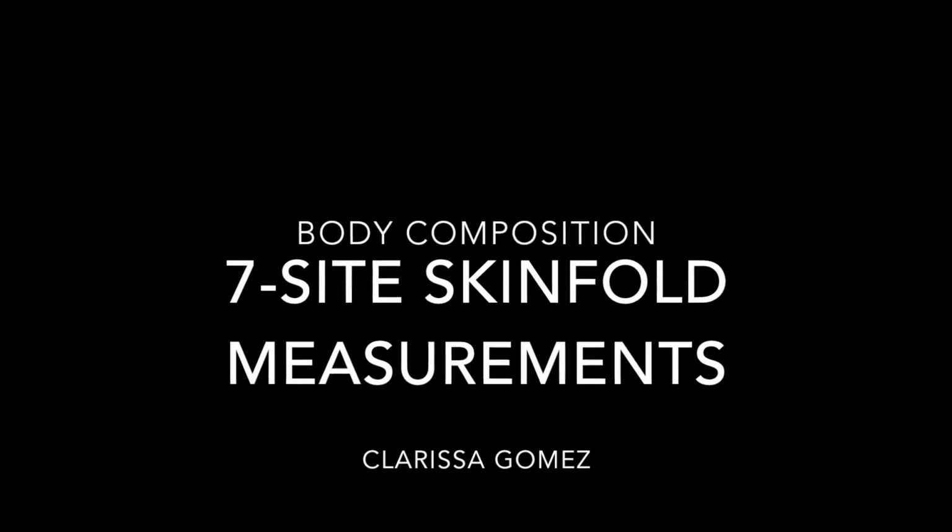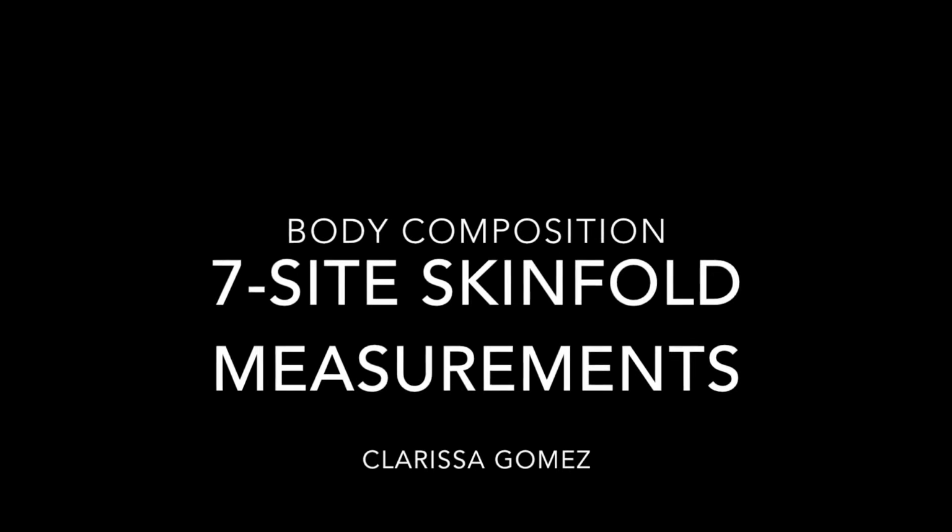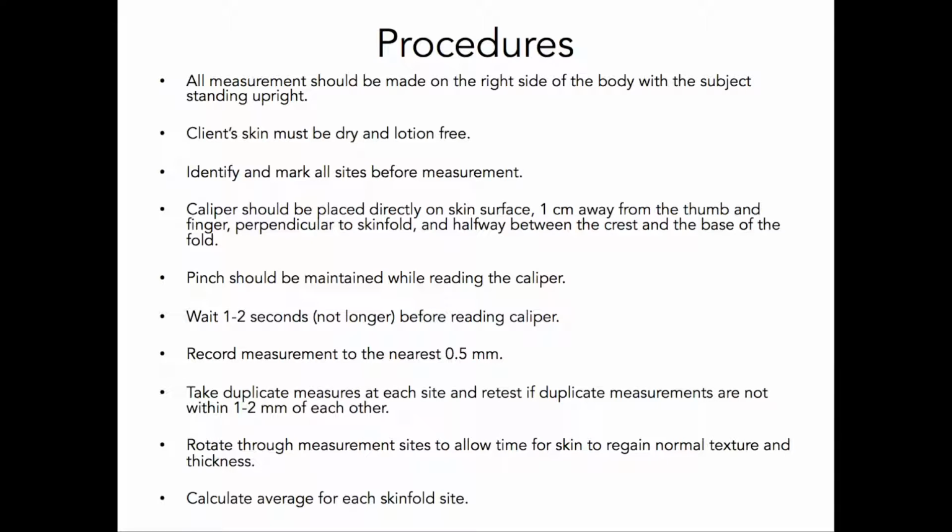Today we'll be assessing body composition by measuring 7 skin fold sites. Before beginning, keep in mind that all measurements should be made on the right side of the body with the subject standing upright. Client skin must be dry and lotion-free. You want to identify and mark all sites before taking measurements.